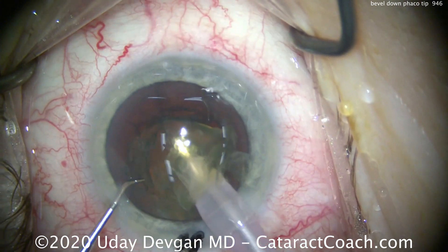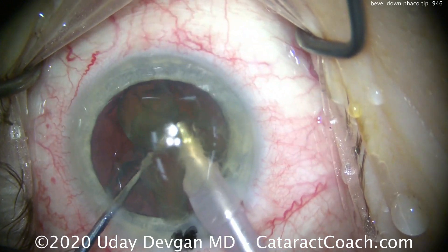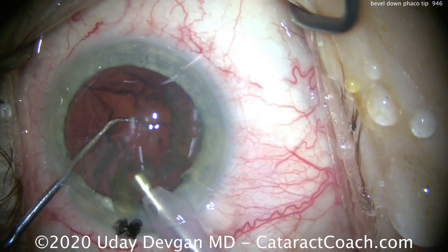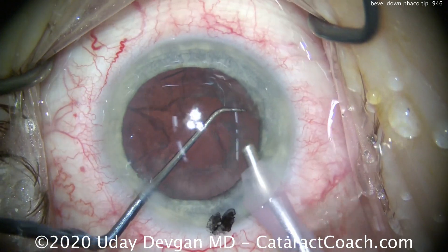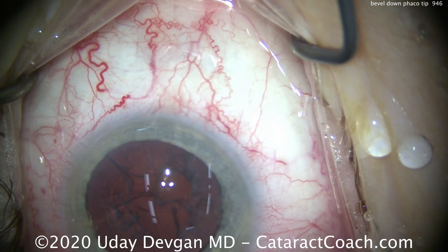And once you get occlusion, the peristaltic pump will increase the vacuum. So in a case like this, where I'm using a peristaltic machine and I have a nucleus to chop, we want to go bevel down because the second the phaco tip hits the nucleus, it's already in a position to be occluded. I don't have to bury it very deep into the nucleus. That's the reason why I go bevel down.